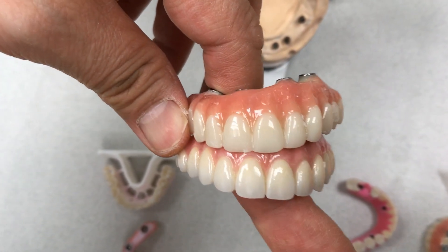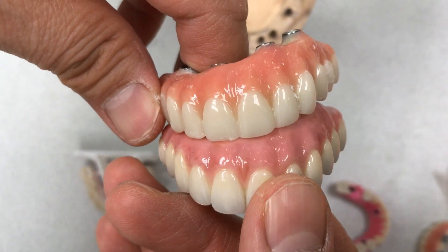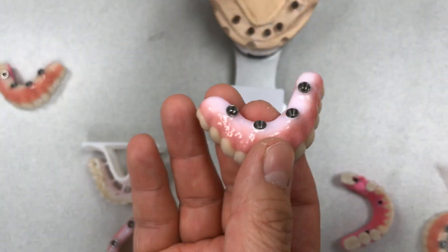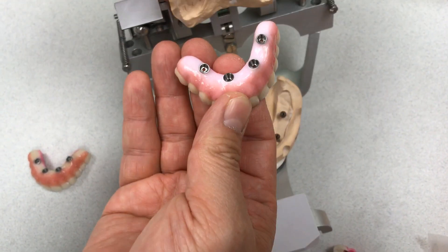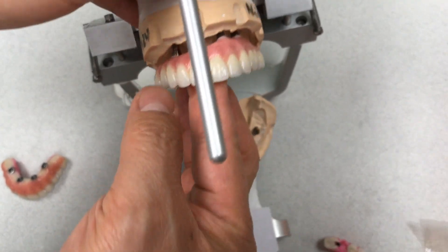Just like more life-like restorations, especially designed by the tissue. We put a little bit more stain in between the teeth, so the fit is better for the patients. This is the upper — it's no problem to mill, everything's good.